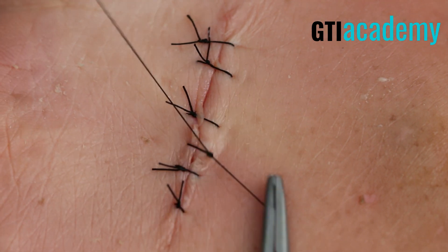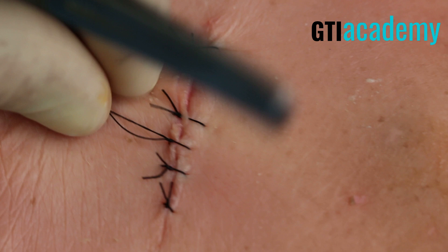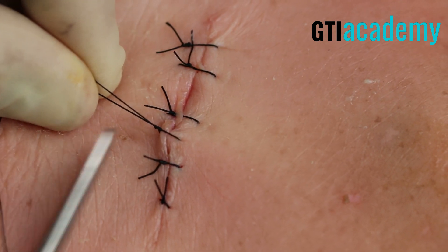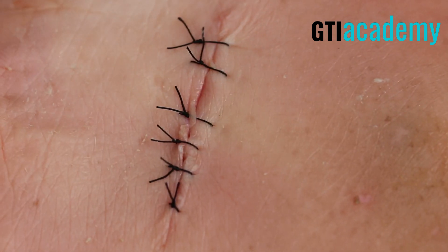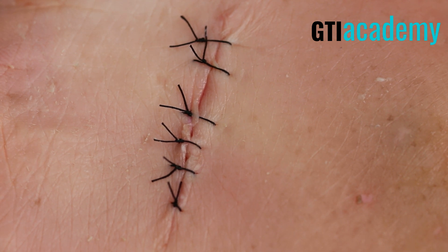Nice surgeon's knot here, and a third throw. Let's pull this knot to the left to make all of them be on the same side. Again, equal lengths.